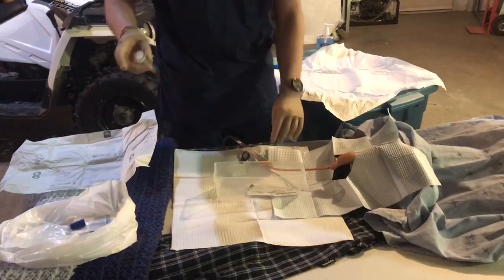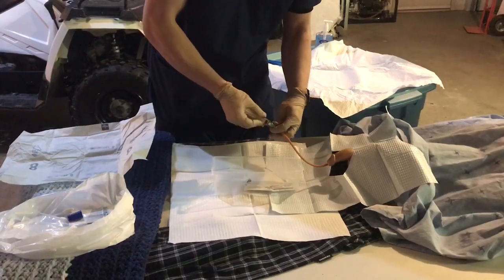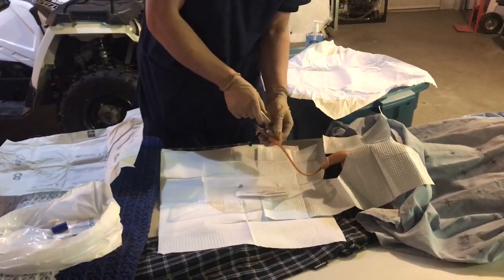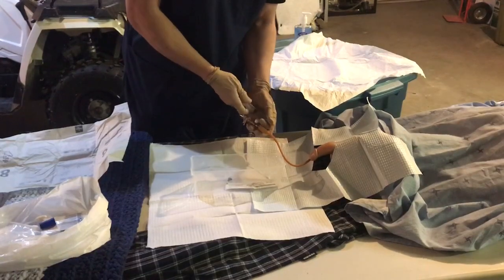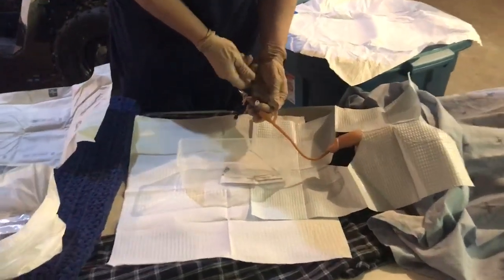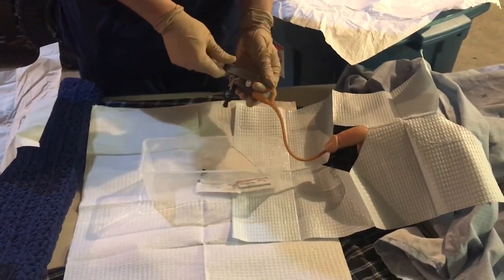I will grab my syringe and insert that into the balloon port there. And then I will tell the patient that I'm going to be removing the water now. Let him know what I'm doing as I'm doing it. So I'm going to make sure I do remove the full 10 ml. So I'm certain there I have the full balloon deflated.